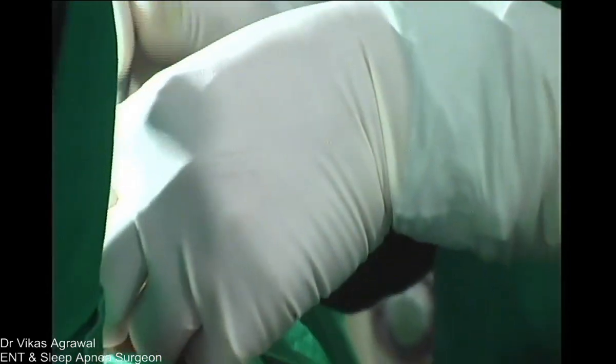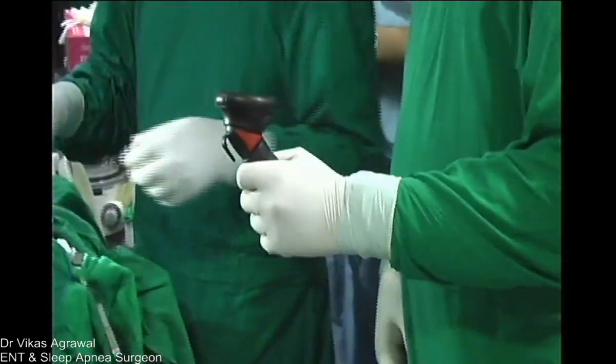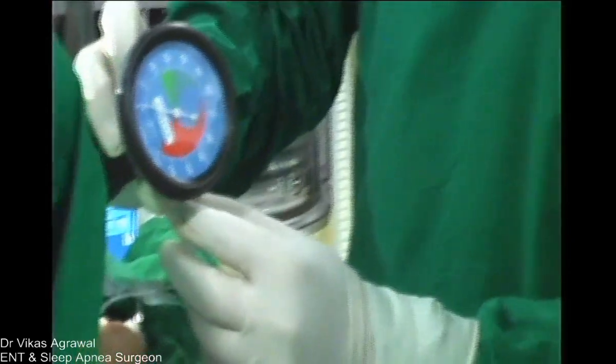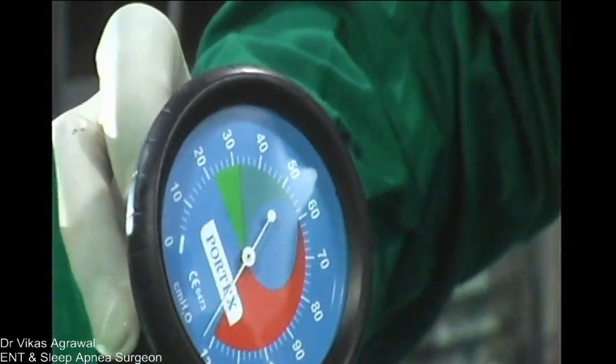Give me that, the periosteum elevator. Just give me one moment. I'll show you that will inflate. We have a pressure gauge to know how much pressure we are applying. Now show this. It's going. So now see this. Can you see this? So we know that we have inflated it beyond 120, very high pressure.